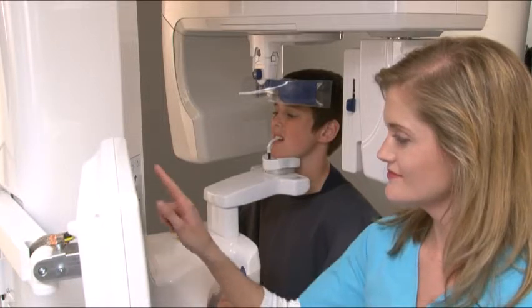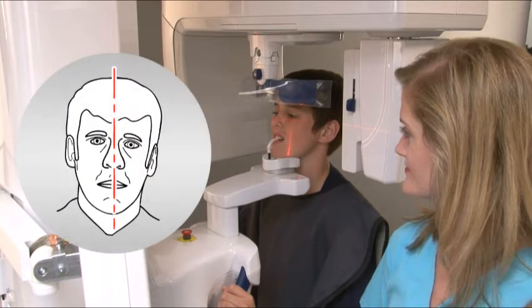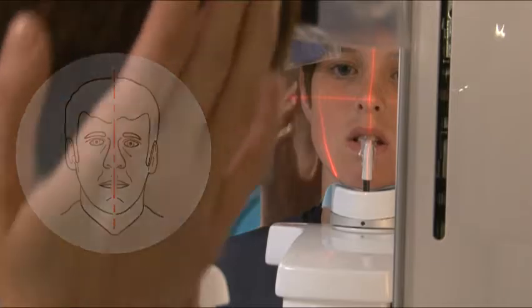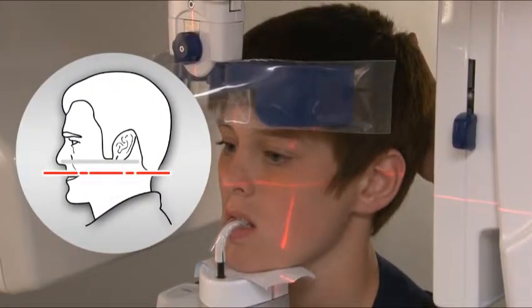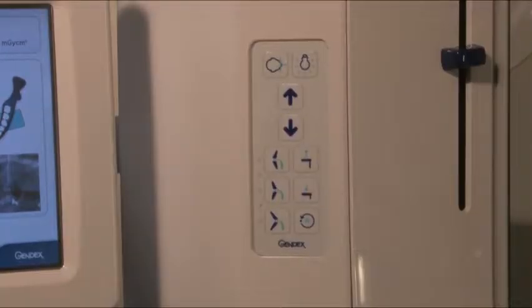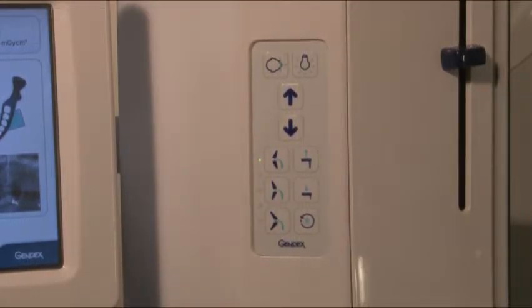Press the laser button to initiate the laser alignment lights. For mid-sagittal placement, verify that the patient's head is not tilted or turned to one side. For horizontal placement, use the up-down buttons to bring the patient's occlusal plane parallel to the laser. For lateral vertical placement, adjust the anterior posterior movement buttons. The laser line will not readjust, but the change in position will be compensated for at capture.